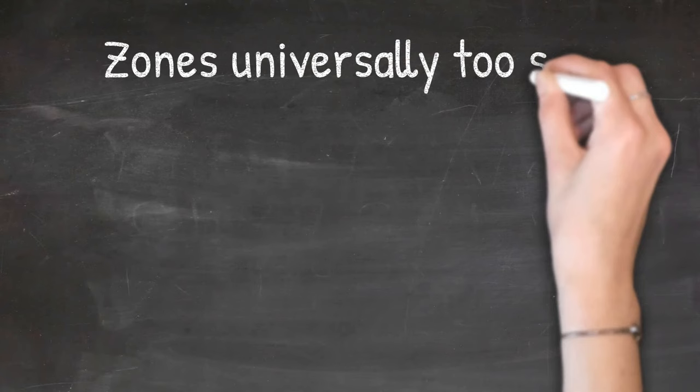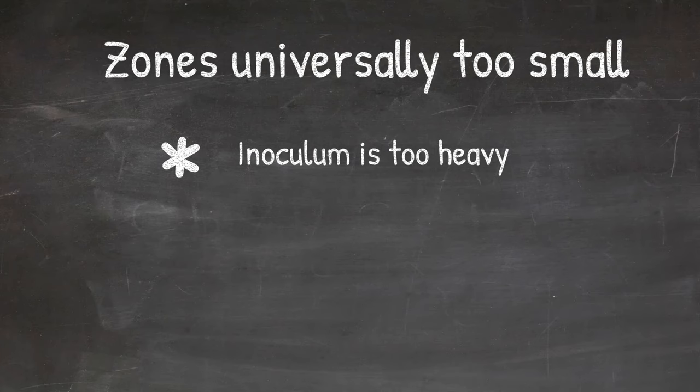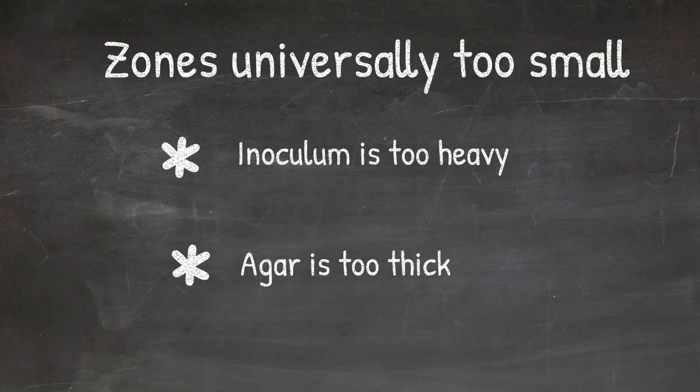If the zones are universally too small on control plate, it means inoculum is too heavy, or agar depth is too thick. The same thinking as when you get zones universally too large, just reverse the reason.